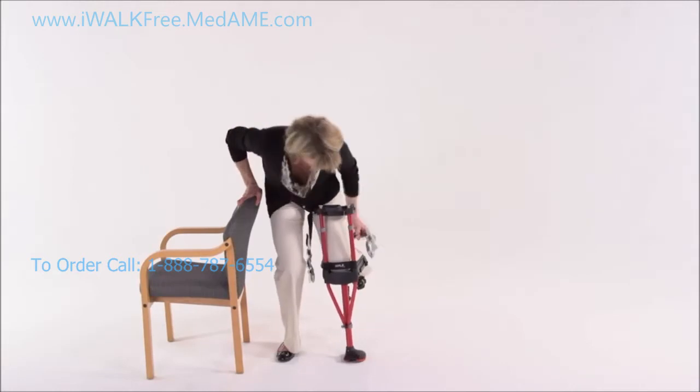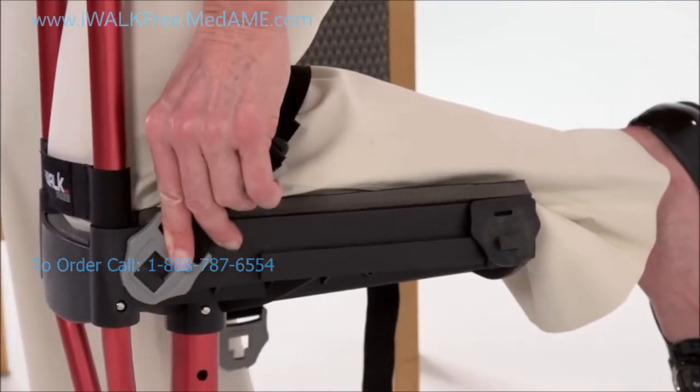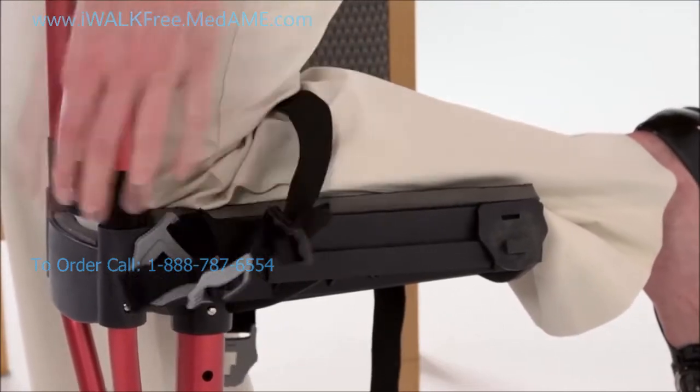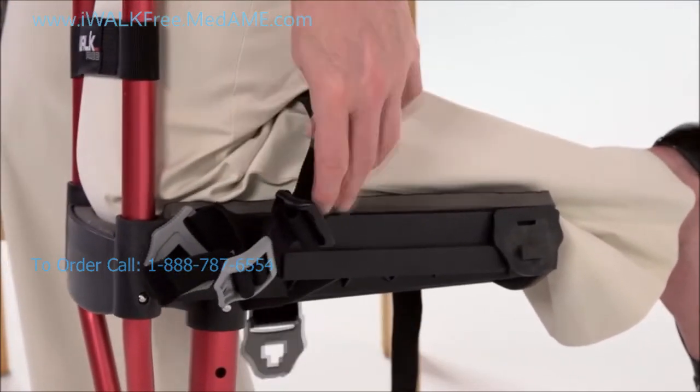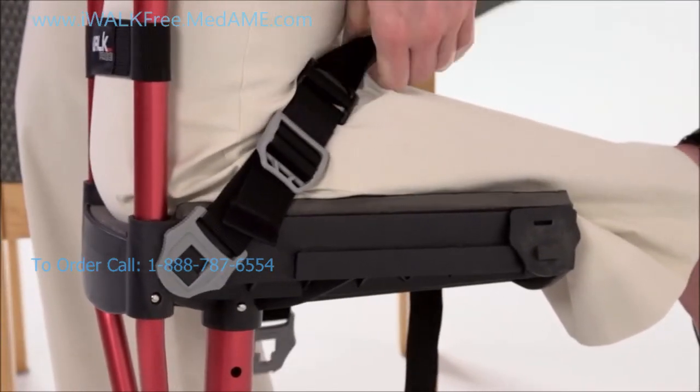Drape the strap over the back of your knee and attach the grey T-lock buckle to the front of the platform. Make sure your knee is all the way forward and pull up and over on the adjustment end until the strap is snug but not fully tight.